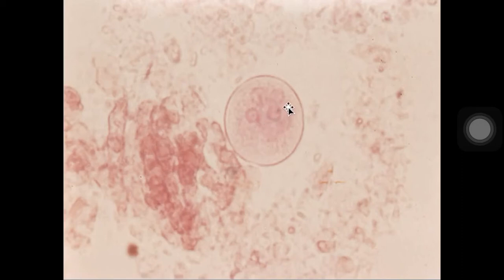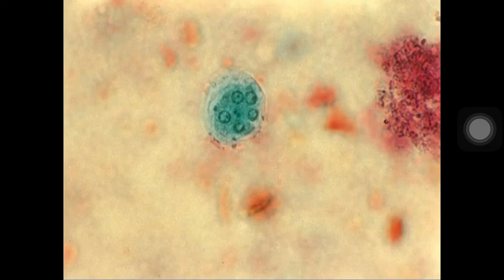Ito parang mukha namang quite larger siya as compared to sa mga images kanina. Pero syempre, kailangan natin ng micrometer kapag gano'n. Kailangan may unit of measurement para talagang ma-identify natin na mas malaki siya, because coli will be larger than your histolytica, of course. Okay, then this one is your Entamoeba coli cyst as well.